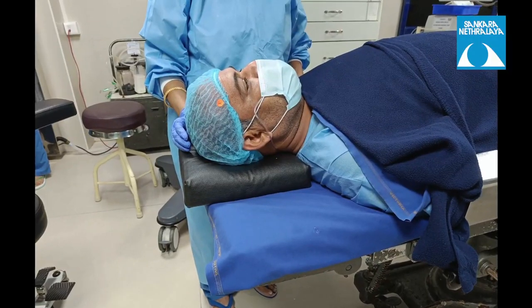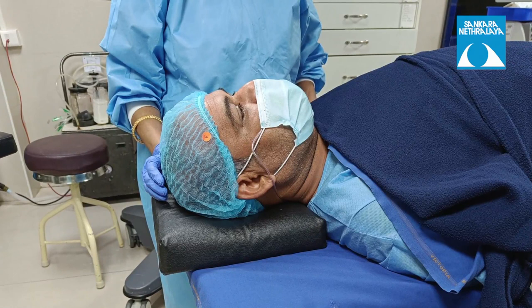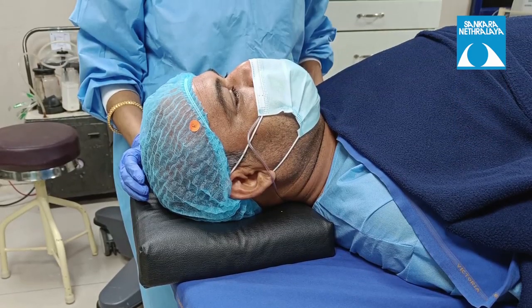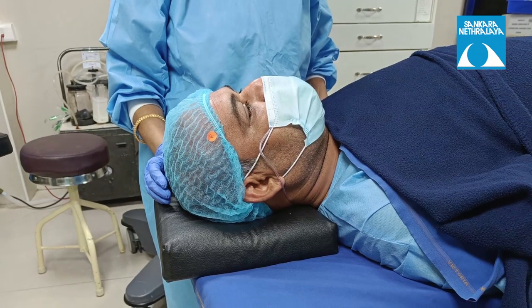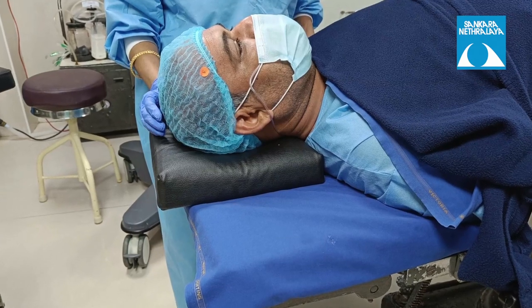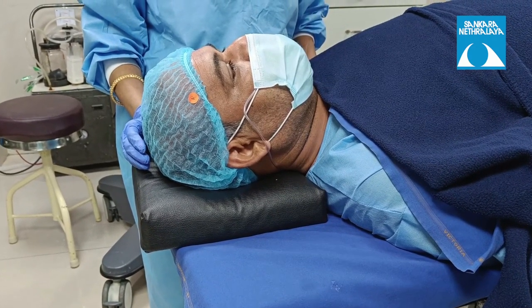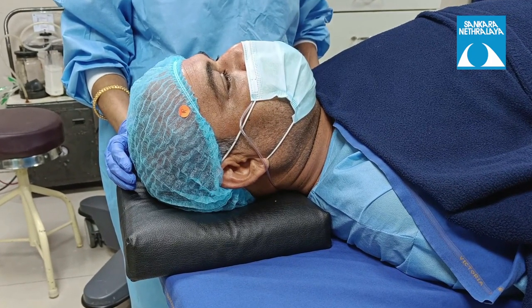The patient is then greeted by the anesthetist and the surgeon, and the whole procedure of local or general anesthesia as well as the surgery is well explained to make the patient less anxious and more cooperative while under the drapes. Always cross-check the patient's initials and the eye to be operated before the anesthetist blocks the eye, to remove any remote chance of wrong-eye error.